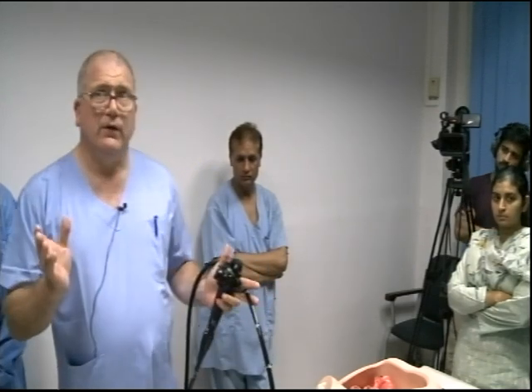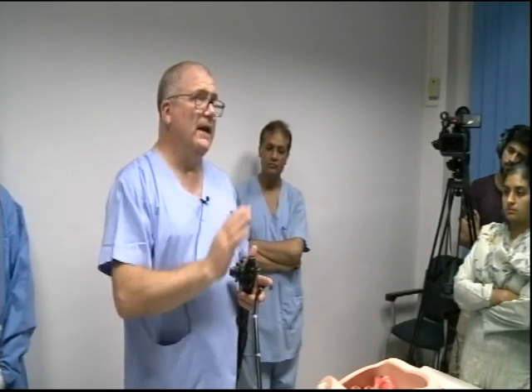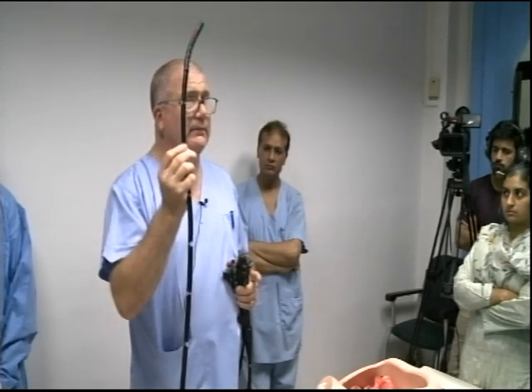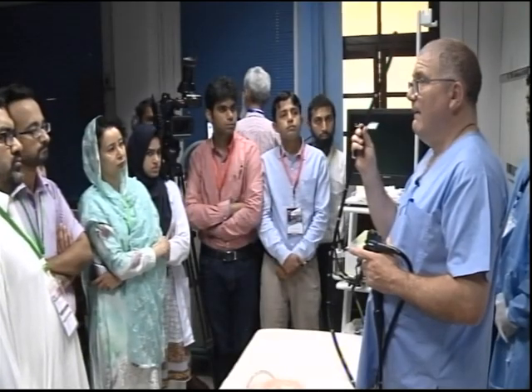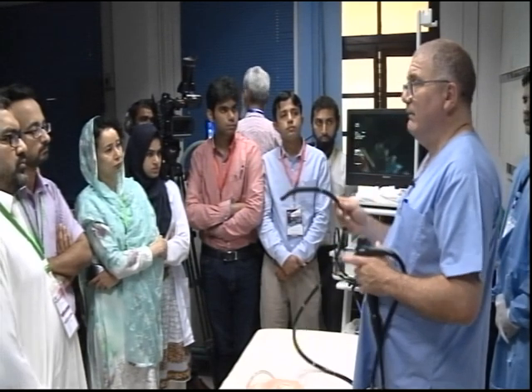I know where the tip is. That's very important to remember. Because when it goes the opposite direction, it means the tip is down. And then you have to be able to adjust what you're doing accordingly. Happy with that? Or do you want me to go over it again?